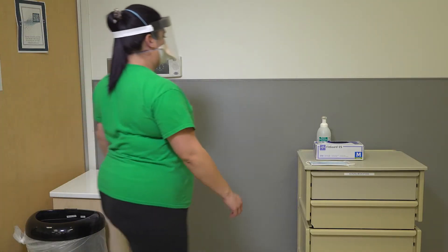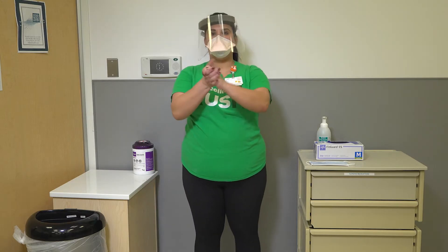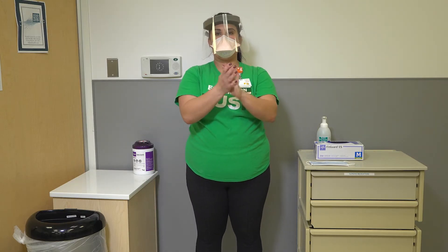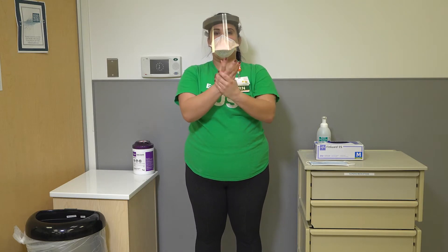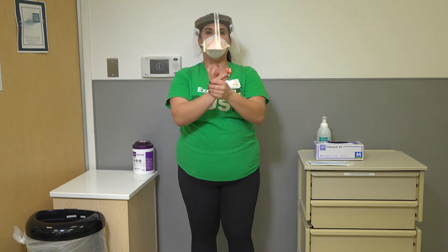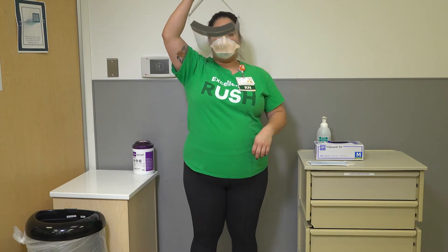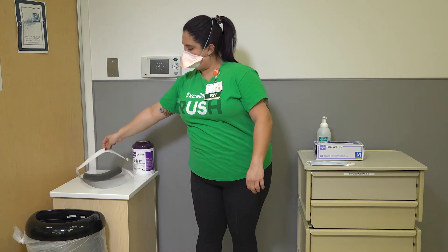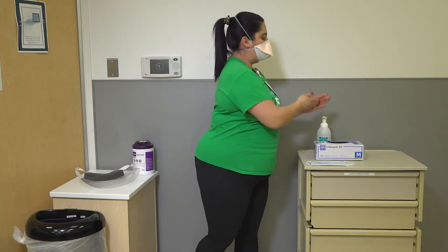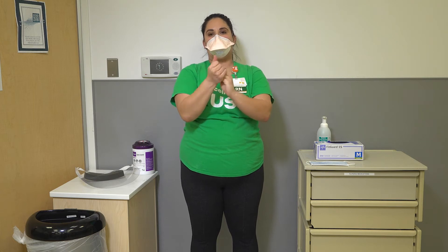Once outside of the isolation room, perform hand hygiene before removing your face shield or goggles. Remove face shield or goggles from back to front by lifting the headband up and over the head, being careful not to touch the face or eyes. If the item is reusable, place in a designated receptacle or surface for reprocessing.